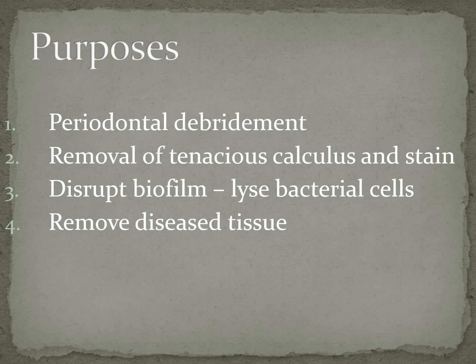Okay. It's also going to help us remove tenacious calculus and stain. So really hard calculus is going to be hard on our hands to remove. Stain is going to be hard on our hands to remove. So if we use the ultrasonic scaler, that's going to help our hand scaling.